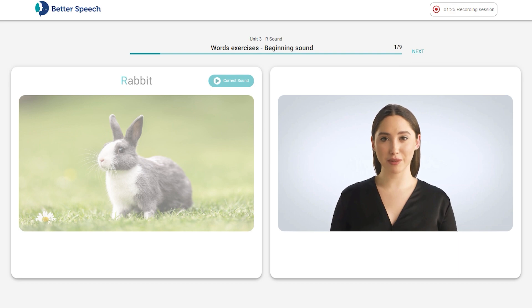Then I'll give you my feedback. Here's the first word. Listen to the correct pronunciation, then say the word three times. Let's give it a try.